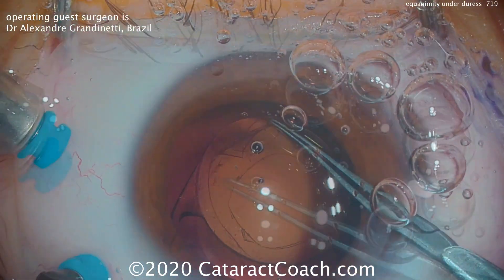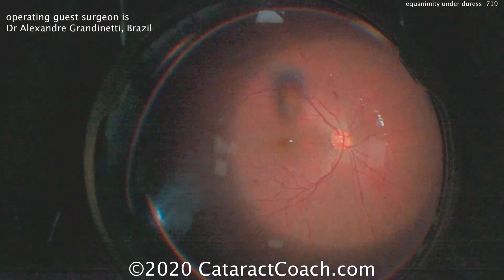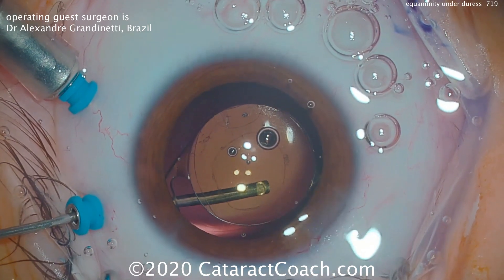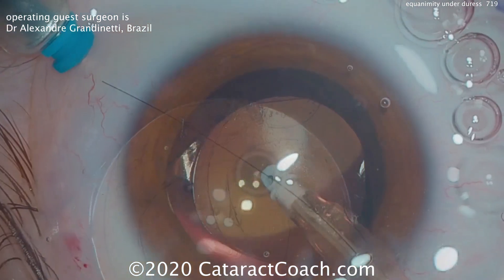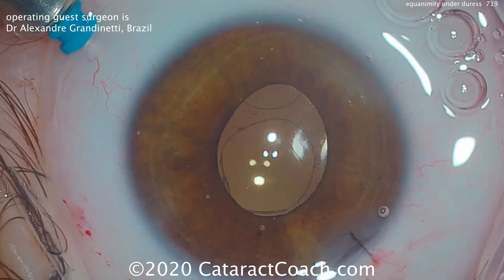We also open up the central posterior capsule. Completing the anterior capsulorrhexis to enlarge it just slightly — the outcome is great. There's the view of the fundus; everything looks good. This patient is going to have a beautiful outcome. Very nice case. The patient won't need a YAG capsulotomy later, and there was essentially no downside to this.